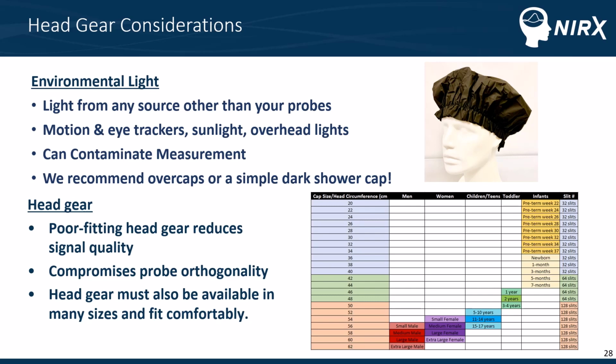And over on the right, we've got an image of the NIRx NIRS cap sizing chart. We do offer a variety of sizes for the head circumferences throughout development, having smaller sizes for the preterm and newborn ages, and then larger head sizes for adults.